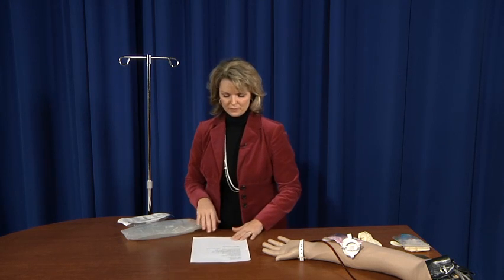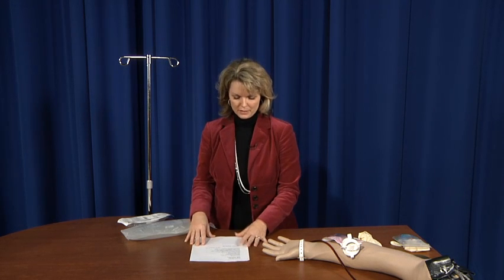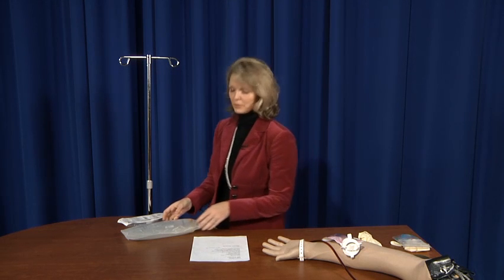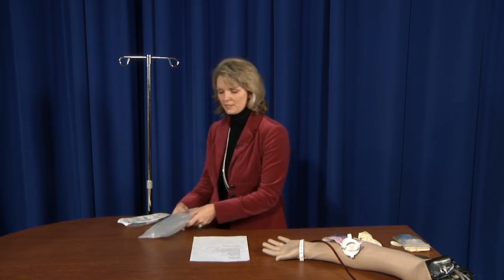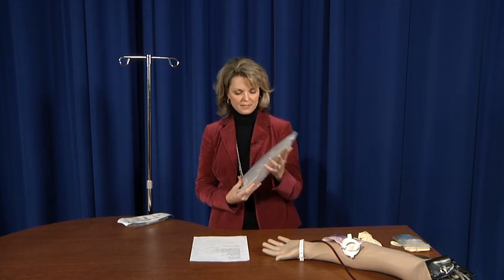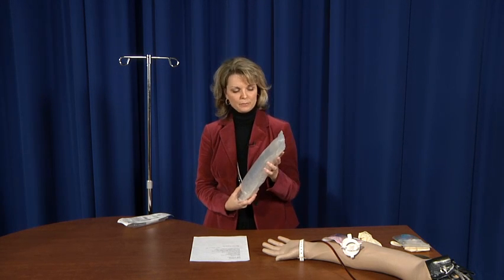When we first start initiating an IV, what we need is a doctor's order. So you'll go to the chart and find the doctor's order. This particular doctor ordered normal saline at 150 cc's an hour. So what we're going to do is find some normal saline. This is a bag of normal saline. This is 1,000 cc's or milliliters.